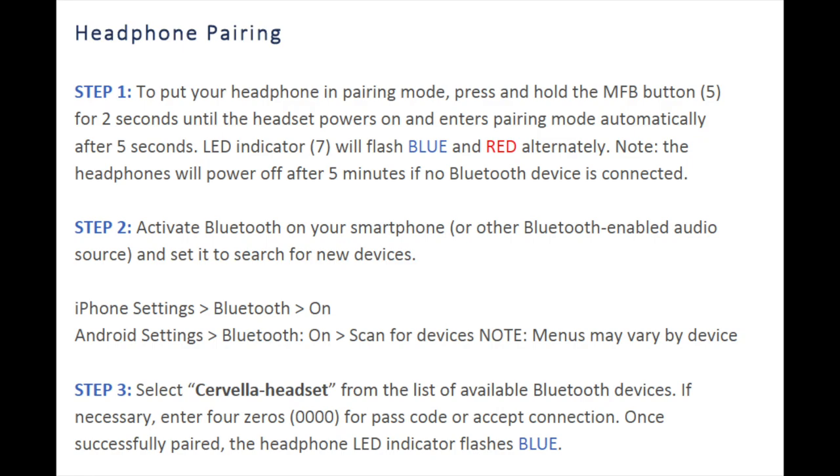Note that you will have two separate Bluetooth connections: one connection is between the Cervella app and the Cervella device, and the second Bluetooth connection is between the audio source device and the Cervella headset.